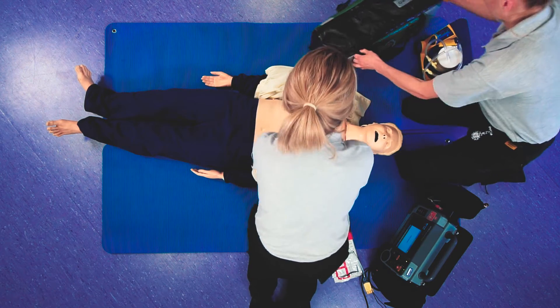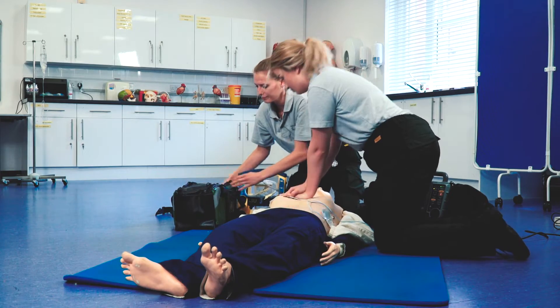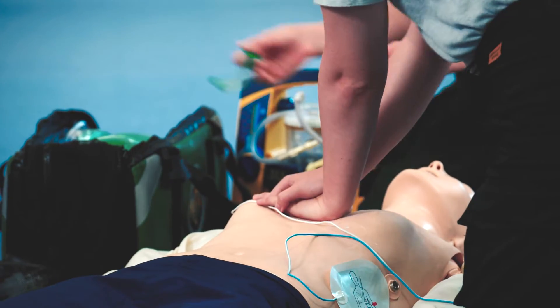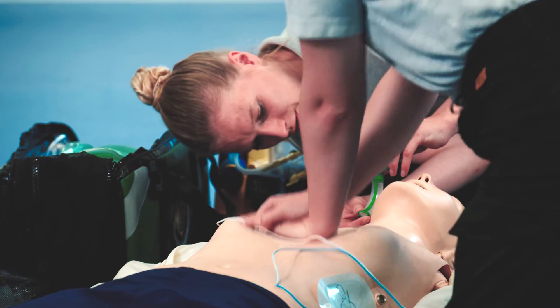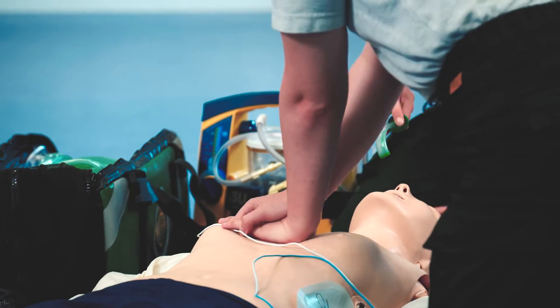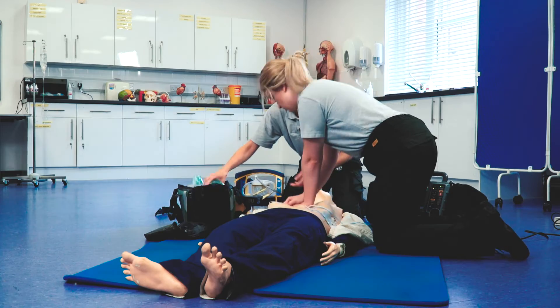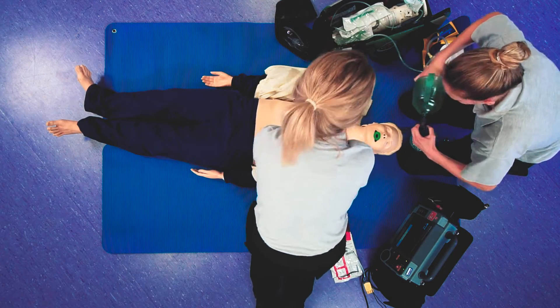So I'm going to secure the airway. I'm going to get an OP airway — got to measure that. So from the tip of the incisor to the angle of the jaw. Pop it in the wrong way around, then twist it. Ventilate. And then get the oxygen running on the BVM.